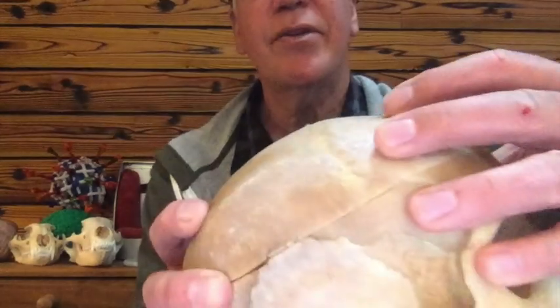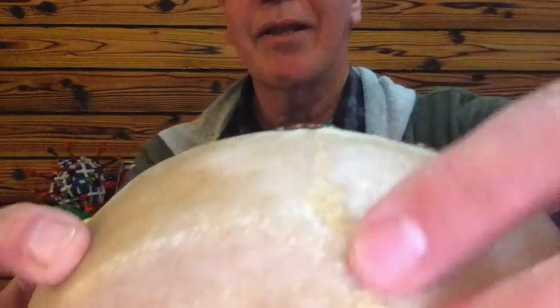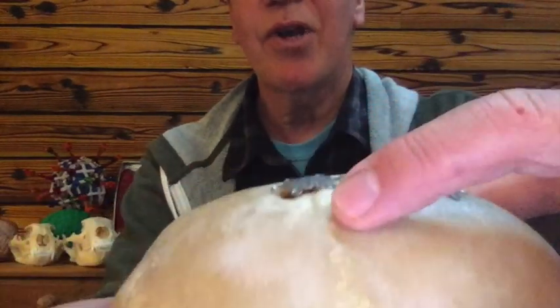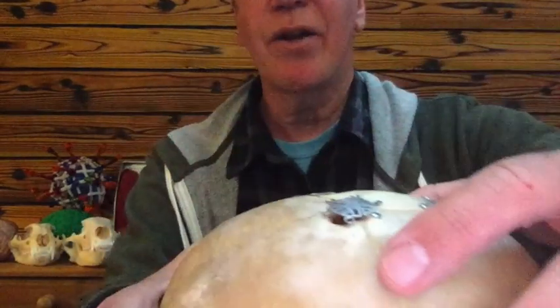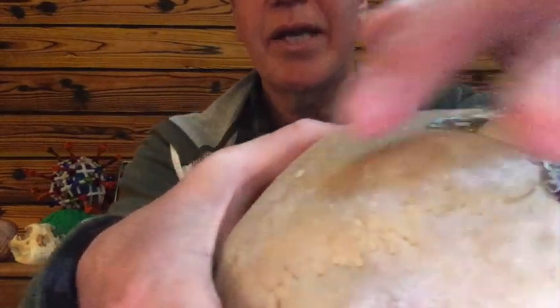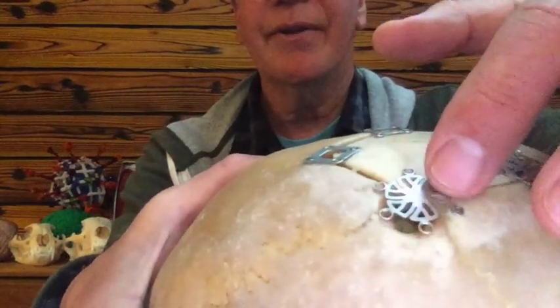But it's kind of faint to see. But let's see, if you look right along here, you can see it looks like a little EEG tracing here. This is called the coronal suture, where this frontal bone fused back here to the other bones, and then along here is what we call the sagittal suture, and where they come together is a point called bregma, and usually they're giving you coordinates based off of that skull landmark, bony landmark on the dorsal surface of the skull.